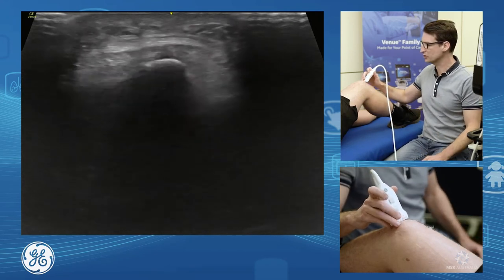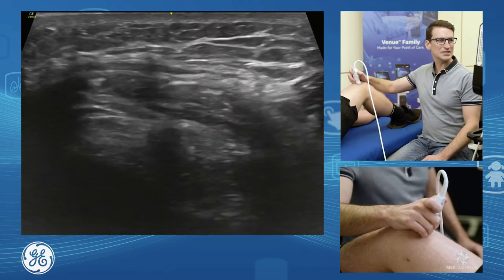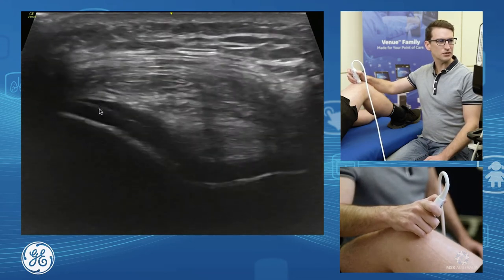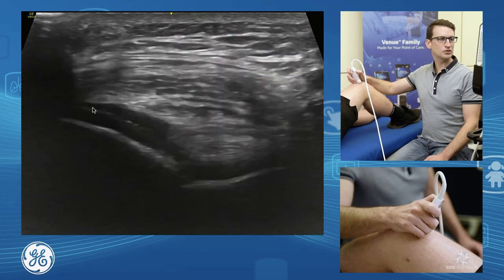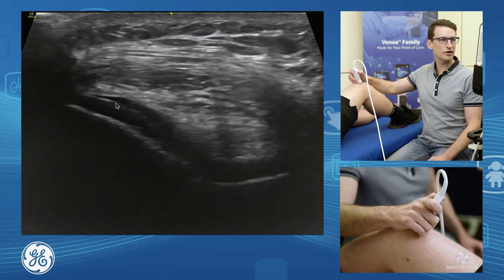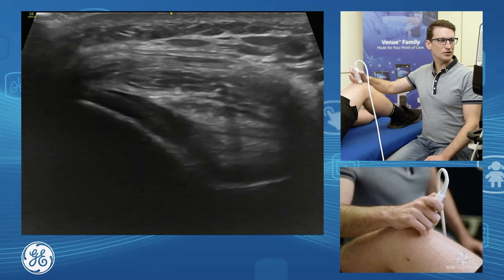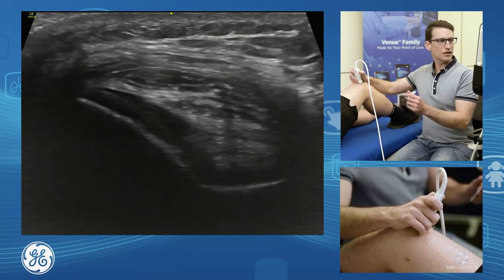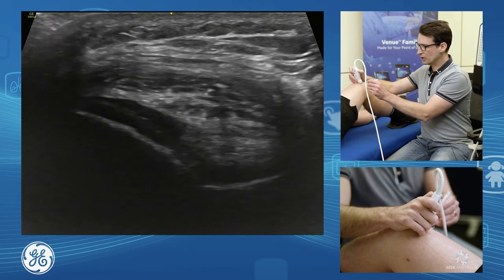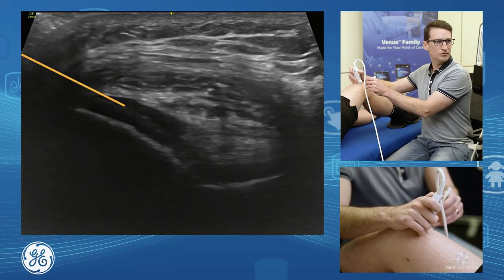Another intervention we might be asked to do is inject the knee joint. The suprapatellar pouch is an excellent spot to inject just under the quadriceps, especially when there's a large joint effusion. Our patient here only has a very small amount of joint fluid sitting over our femoral hyaline cartilage, which limits our window. We can see that's just over a centimetre down — we want to move the injection down a little and just slide in over that hyaline cartilage into the fluid we can see there.